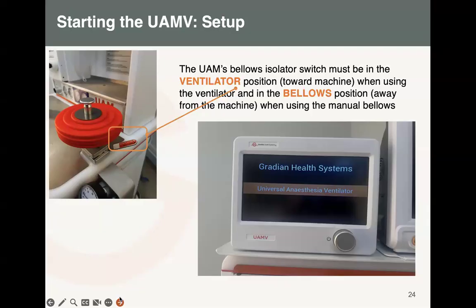Everything is settled, the setting is the same for whatever case comes in. But I really advise you guys, wherever you have your case, alarms should be individualized, because every patient has got his own demand. So always review your alarms and make sure they are physiologically plausible for that case.